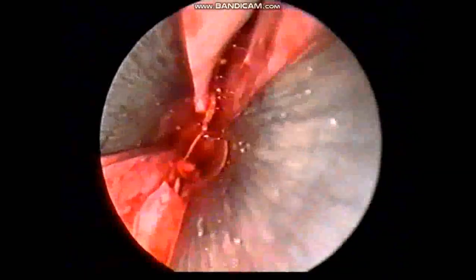That is the maxillary crest. That is the posterior bony portion of the septum, the vomer and the perpendicular plate of the ethmoid. Catch it with the Luc's forceps, break it and remove the posterior bony septum.